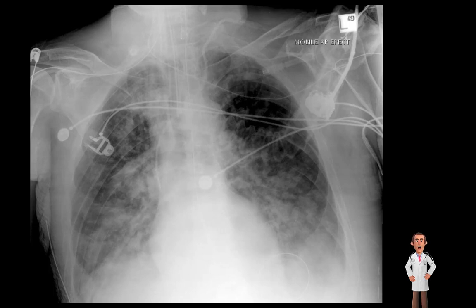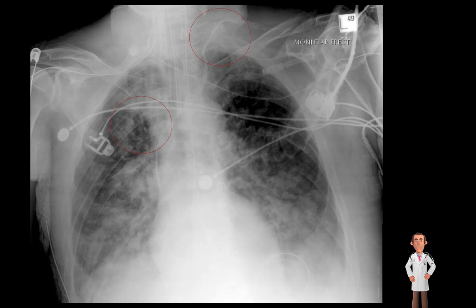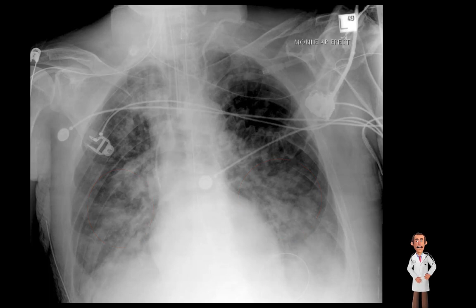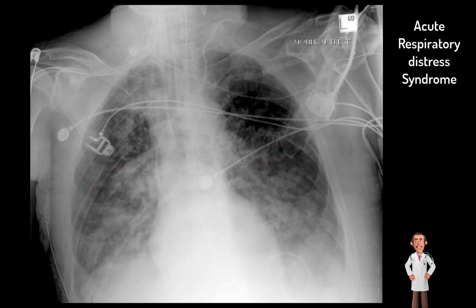Case six. Note that the top right corner says 'mobile AP erect', so this was a portable chest X-ray done in an urgent or possibly emergency setting. The patient is clearly unwell and the technical quality is not ideal. We can see evidence of invasive ventilation, non-invasive and invasive monitoring, and invasive access. This patient was admitted to ITU with septic shock and progressive respiratory failure requiring ventilation. We can see multifocal bilateral airspace opacities distributed in a perihilar lower zone distribution.